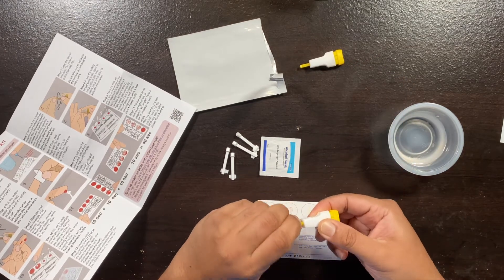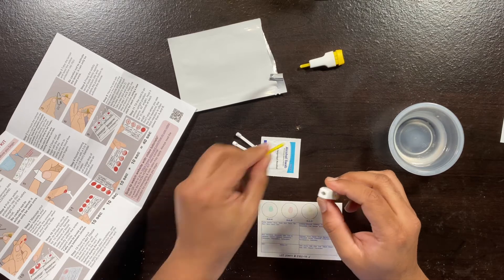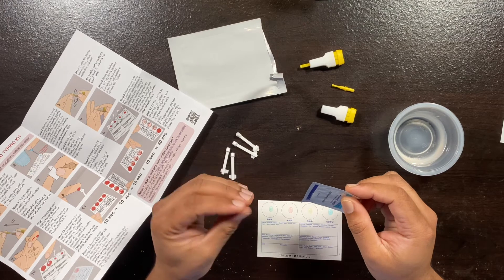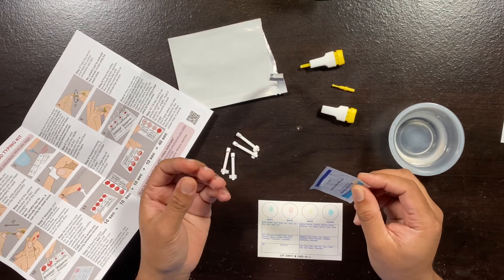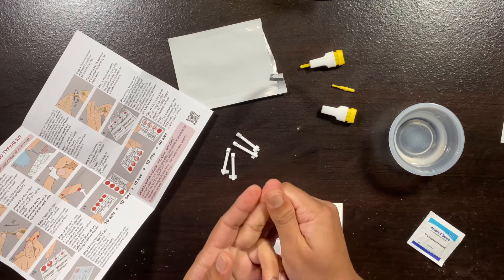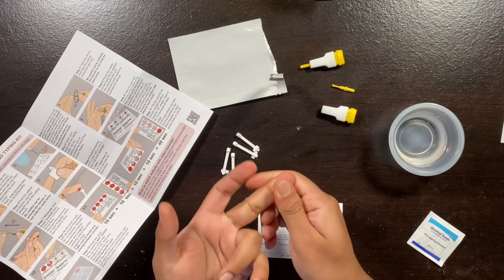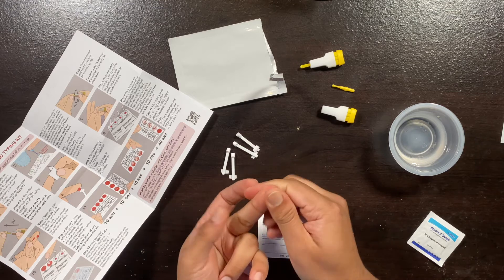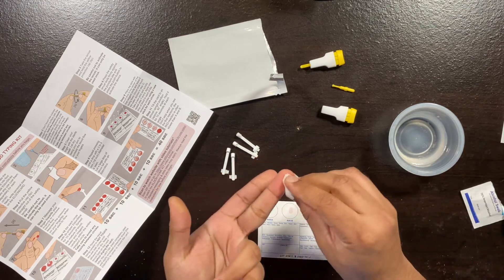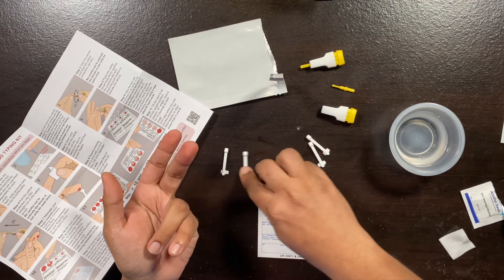Step three: take the lancet and twist off the safety cap. Do not activate it until you're ready — if you push it, it will activate. Step five: clean your finger. I'm going to use my middle finger. Before using the lancet, give your finger a little massage to get good circulation so you don't have to prick more than once. Then open the alcohol pad and clean your finger.